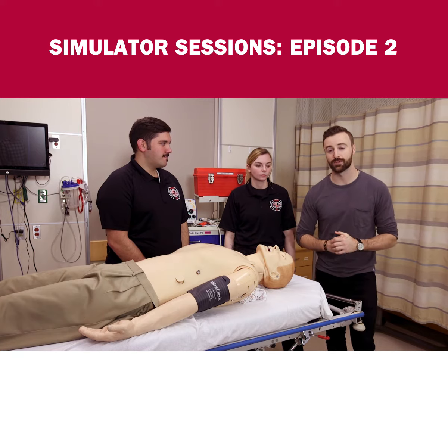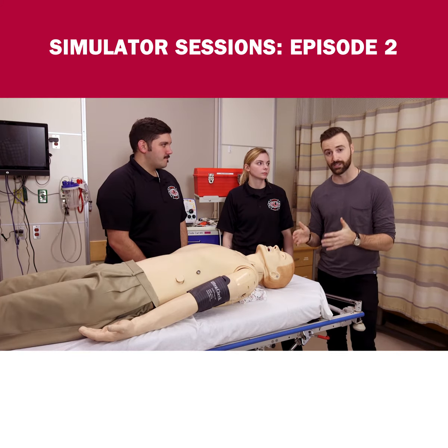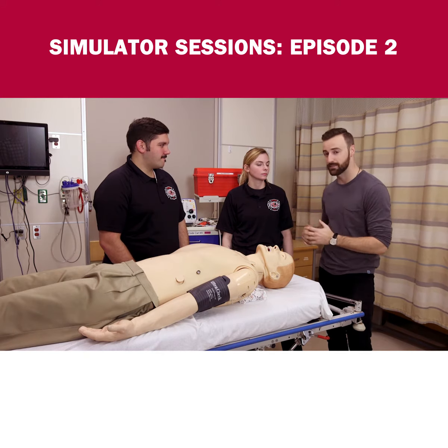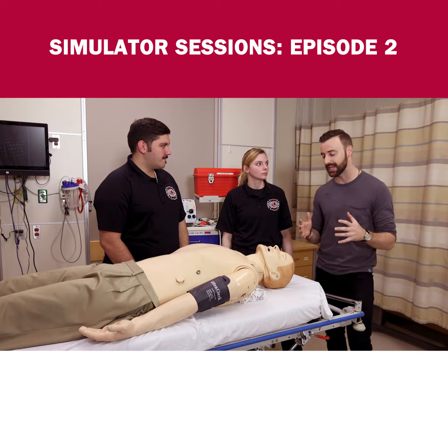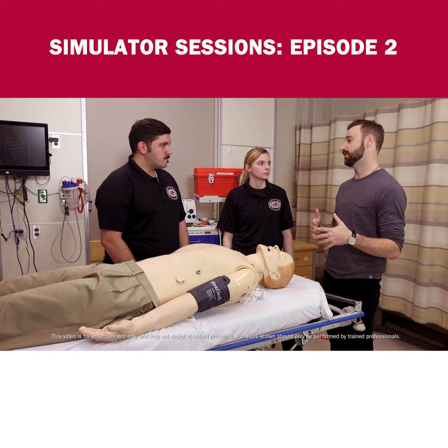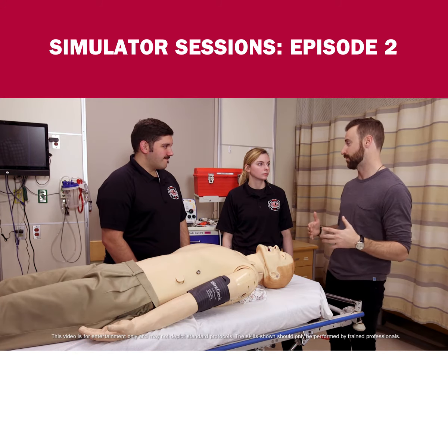Hey guys, James Hinchcliffe here, joined today as always by my trusty buddy John, and also EMT Adam Westfall and paramedic Kat Brophy. Today they're going to show us how to attach a three-lead and also a little bit of defibrillation, which sounds like a great party.